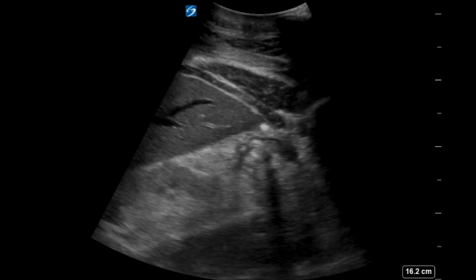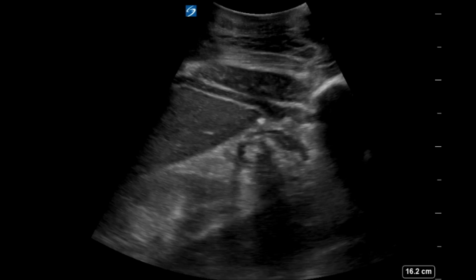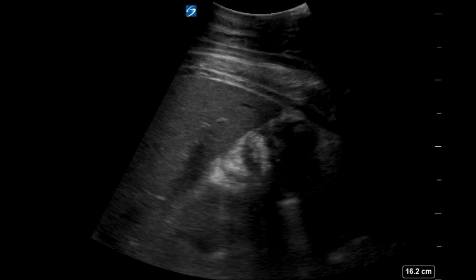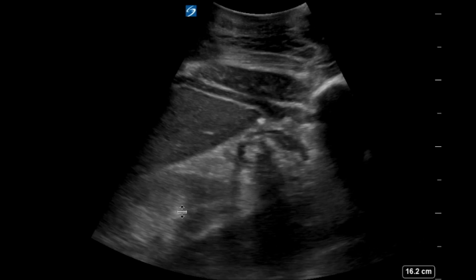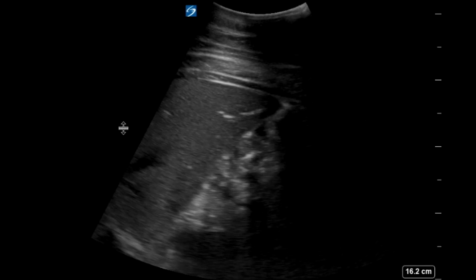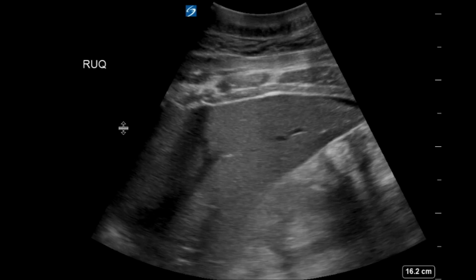Okay. So we're looking here at right upper quadrant. What do you notice? Anything about this right upper quadrant? Looking at the liver, we're looking for kidney below it there. Nothing really standing out too much on this one. Let's take some more views here. One thing that I know they just didn't label, so just make sure you all label your views so we know what you're looking at. They got it on this one though.